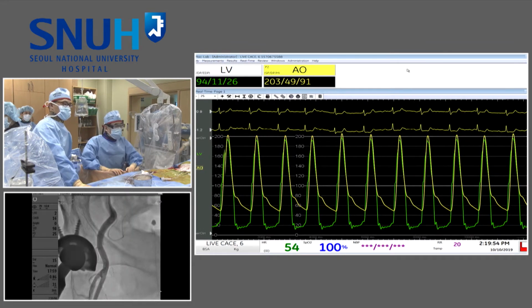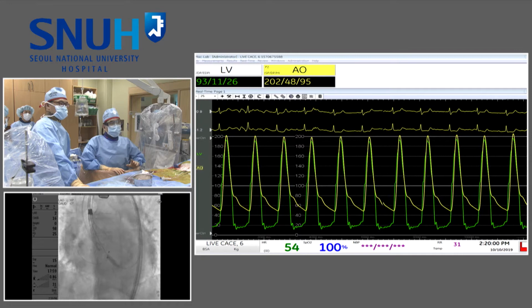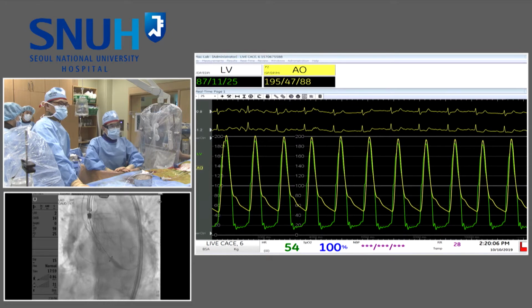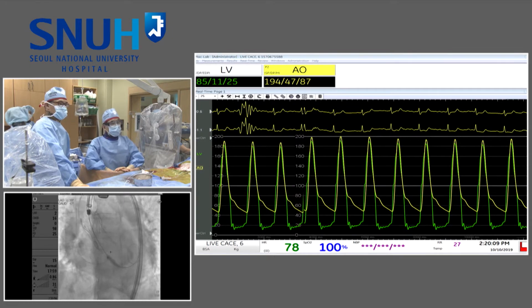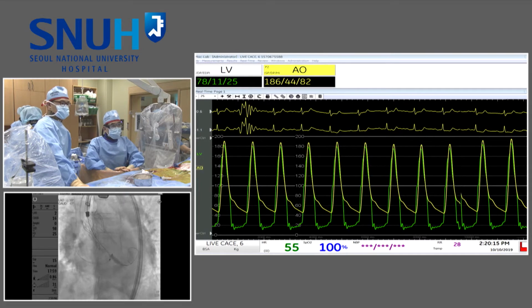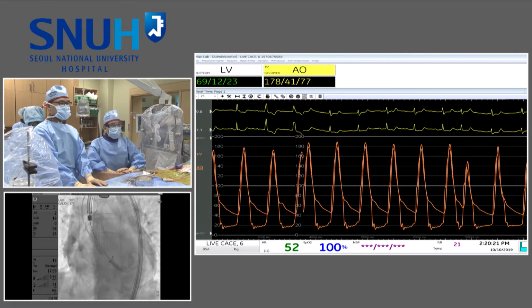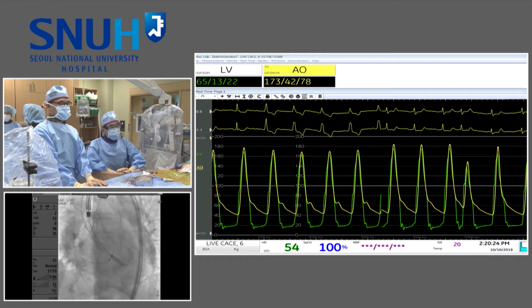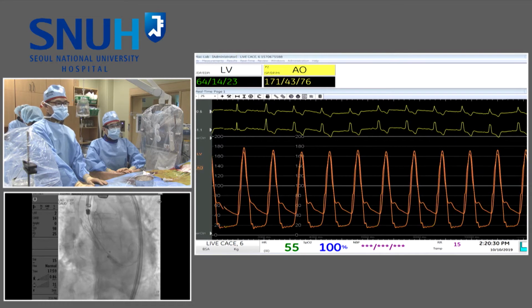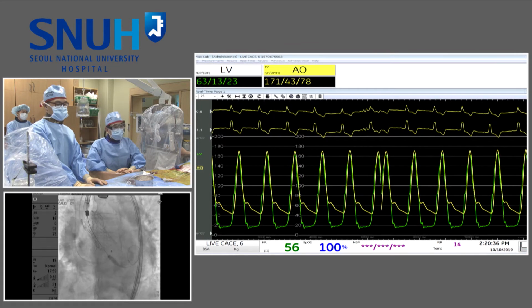When we see the pulse wave, there are two components of the diastolic phase. The first phase is from peak to dicrotic notch. That pressure difference may correspond to stiffness of the aorta. The second component of diastole is from dicrotic notch to end diastolic pressure. That is more appropriately related to paravalvular leakage. In this case, the first component is very high, suggesting a stiff aorta. The second component is very narrow, suggesting regurgitation is mild.